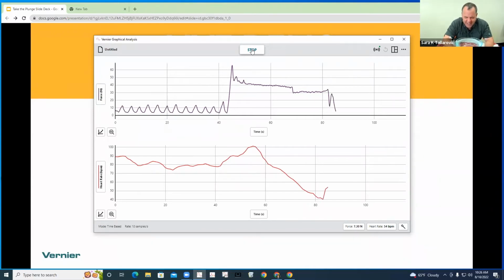All right, I think you can see on the graph already what a different pattern it is with his heart rate. There's an initial rise, but then it really plunges. So again, we can go ahead and stop that a little early. And let's run our analysis now.